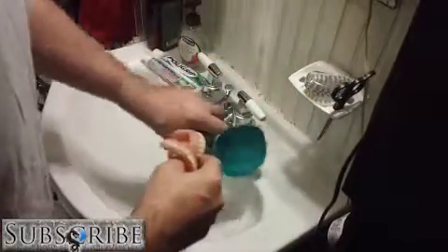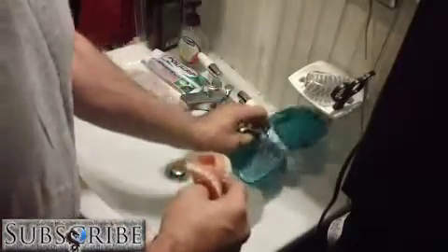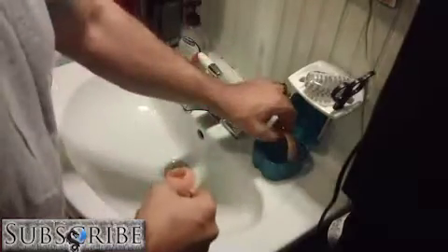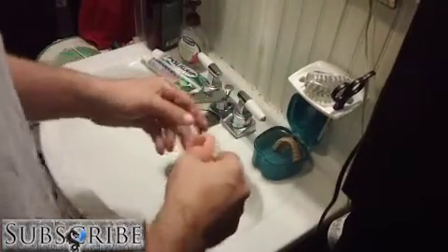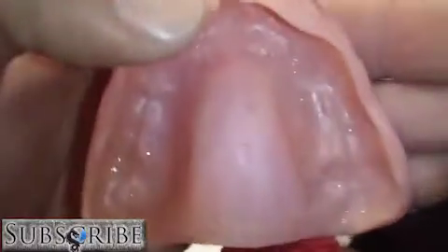Now, there's still a little bit of water in this container, so I'll try dumping that out, because I just dried them off and I don't want them getting wet again. So what I'll do is usually stand them up. A little bit of moisture on the ends, no big deal. And then these guys here, bring up, you can see it's wet. That's the inside. So I take this guy here.